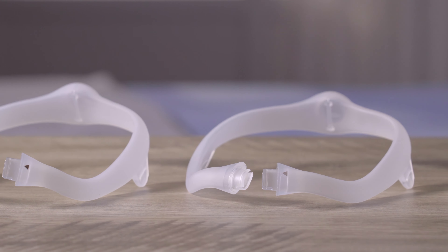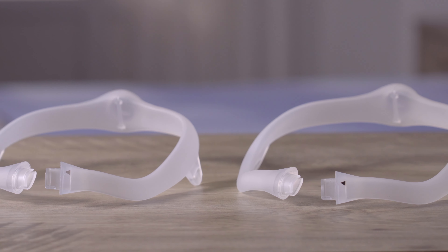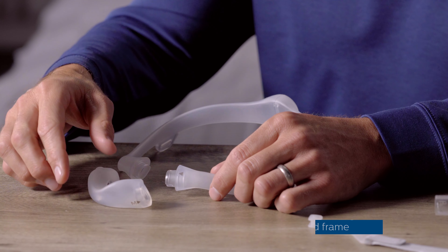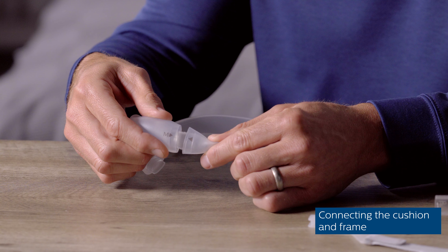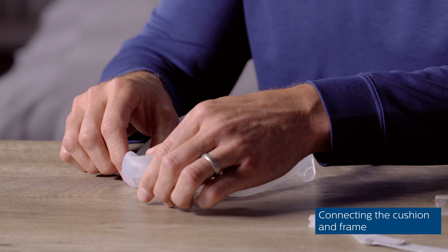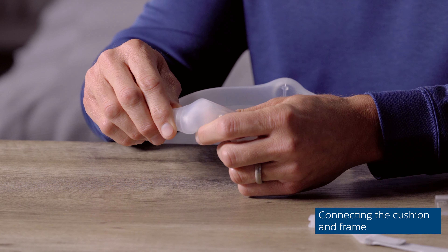Dreamwear frames come in three sizes: small, medium, and large. If your mask is not already assembled, begin by attaching your cushion to a medium frame. Align the triangles on the nasal cushion to the ones on the mask frame, and press until you hear it click into place.